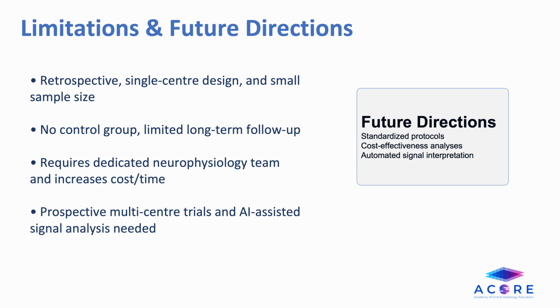Limitations include the retrospective single-center design and small sample size. There was also no control group, and the intraoperative neuromonitoring requires specialized equipment and expertise. Somatosensory evoked potentials were unreliable when cryoablation probes were active. So, motor evoked potentials are the more sensitive modality.